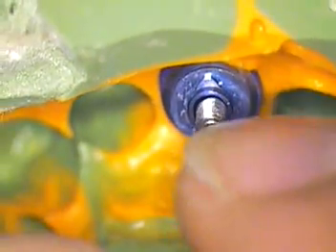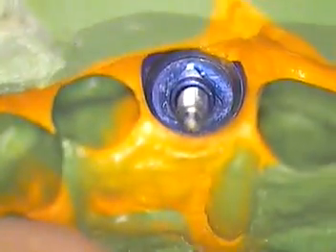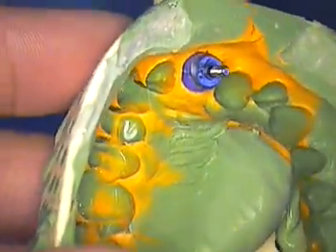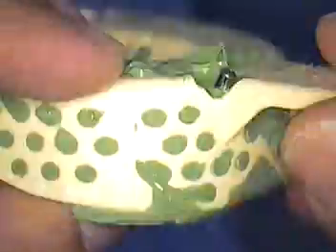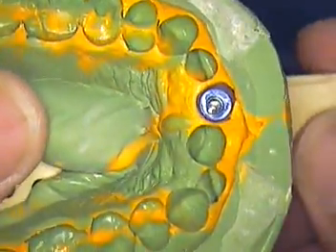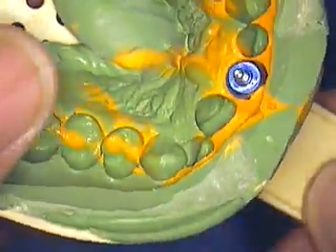We just modify the impression coping, so we don't necessarily have to be locked into one system. The point I want to make here is that you can actually use this idea with other systems. This happens to be an open tray technique with Nobel Biocare and their system, and that is for a central incisor.